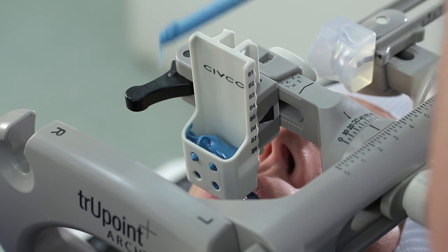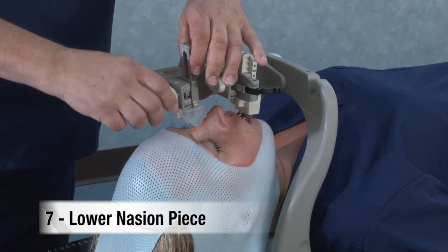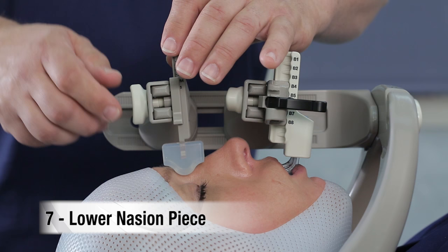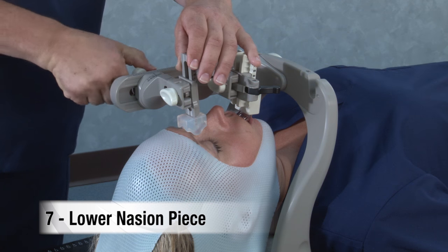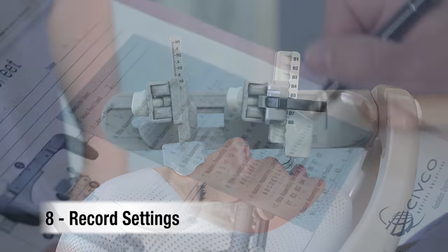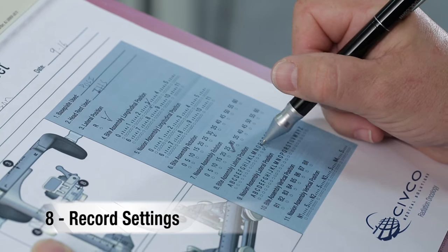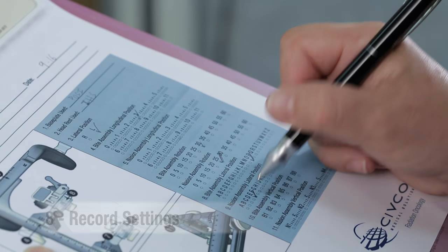Place a new dispensing straw on the putty and completely fill the space in the bite cup with putty. Lower the nasion piece, ensuring that the gel cup is centered and is properly cradling the nasion. Apply as much downward pressure as the patient can tolerate, then tighten the screw. The patient is now ready for simulation. Record all settings on the setup sheet. Once the putty in the bite cup has completely hardened, the arch can be removed.